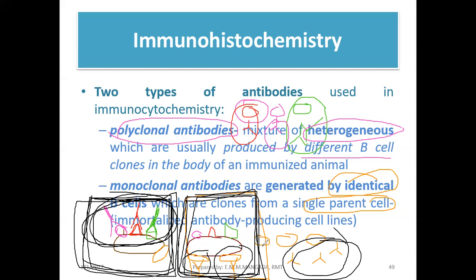Dito, guys, napansin niyo dalawang epitope lang yung merong bound antibody. Bakit? Kasi dalawa lang sila na kulay orange. Dahil gumamit tayo ng monoclonal antibody, identical lahat ng antibody natin. They are directed against epitope orange. Dalawa lang sila. Okay? So ano naman ang implication nun?